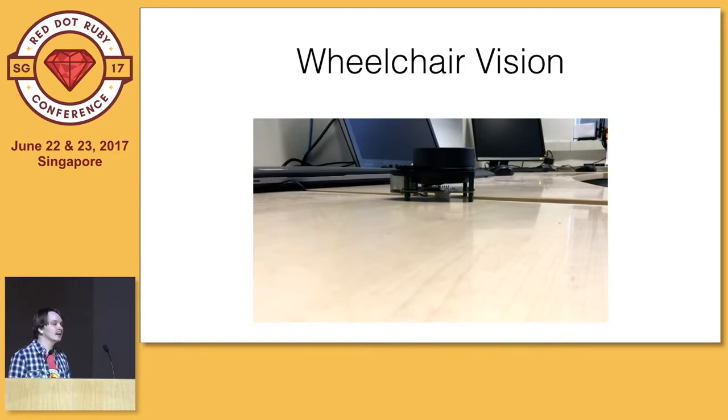Another thing is vision. If you are like me and you never used RC cars as a kid, you might use the wheelchair a little bit too agile, I would say. So you will at one point for sure bump into something. If you are happy, then you just bump into a wall. If you're unlucky, you bump into some other people and maybe move them, even in a wheelchair. So I have to consider protection of the wheelchair, obviously.